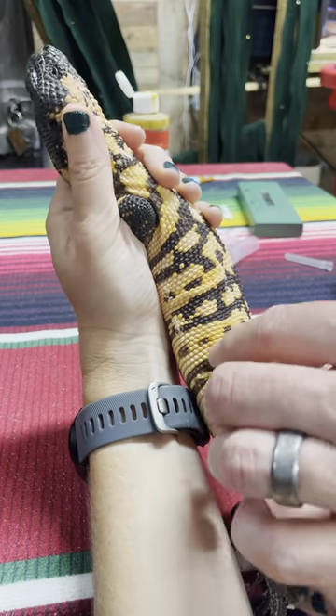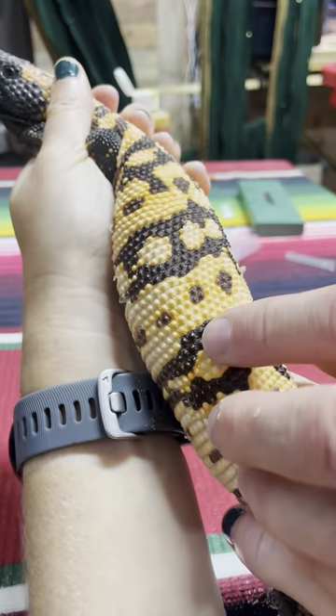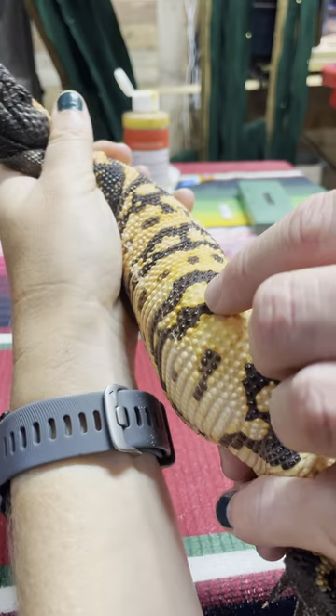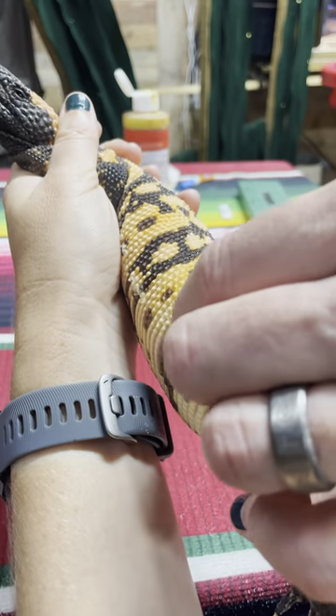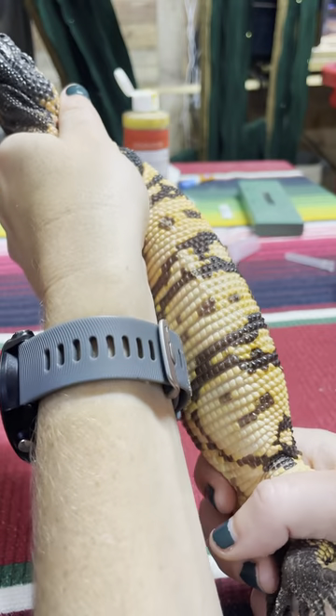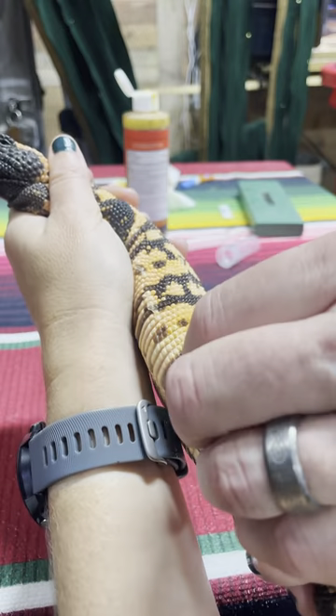The monster skin is beaded — there are actually osteoderms in there, just like the back of an alligator. We're going kind of between two of the osteoderms through the skin, just sub-Q, just underneath the skin. We're not trying to go inside any muscle or inside the internal anatomy of the Gila monster.